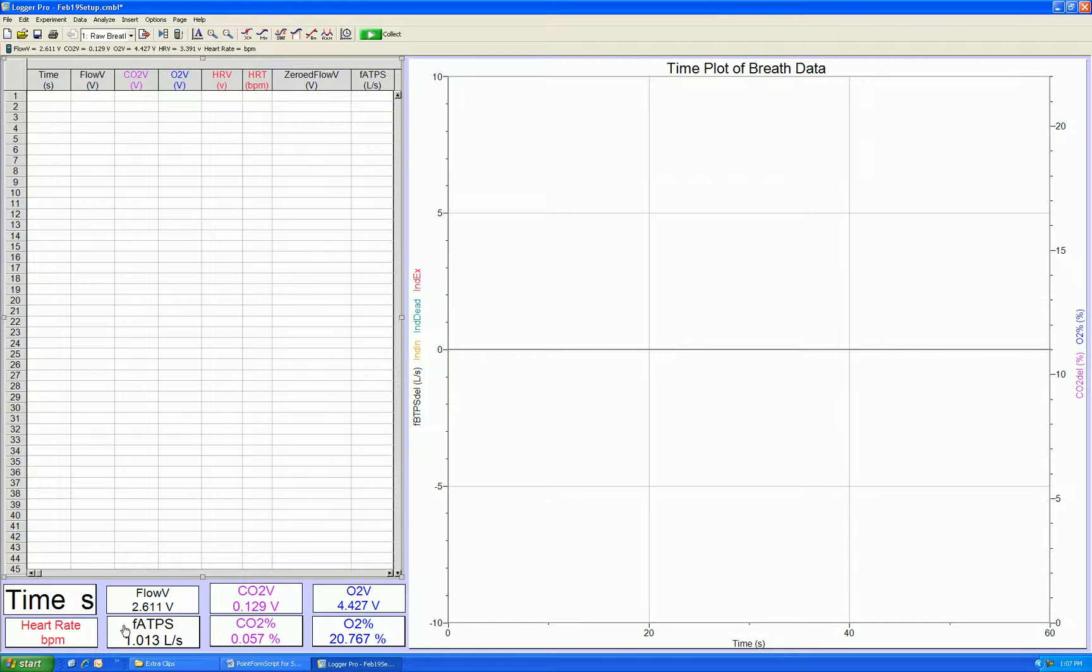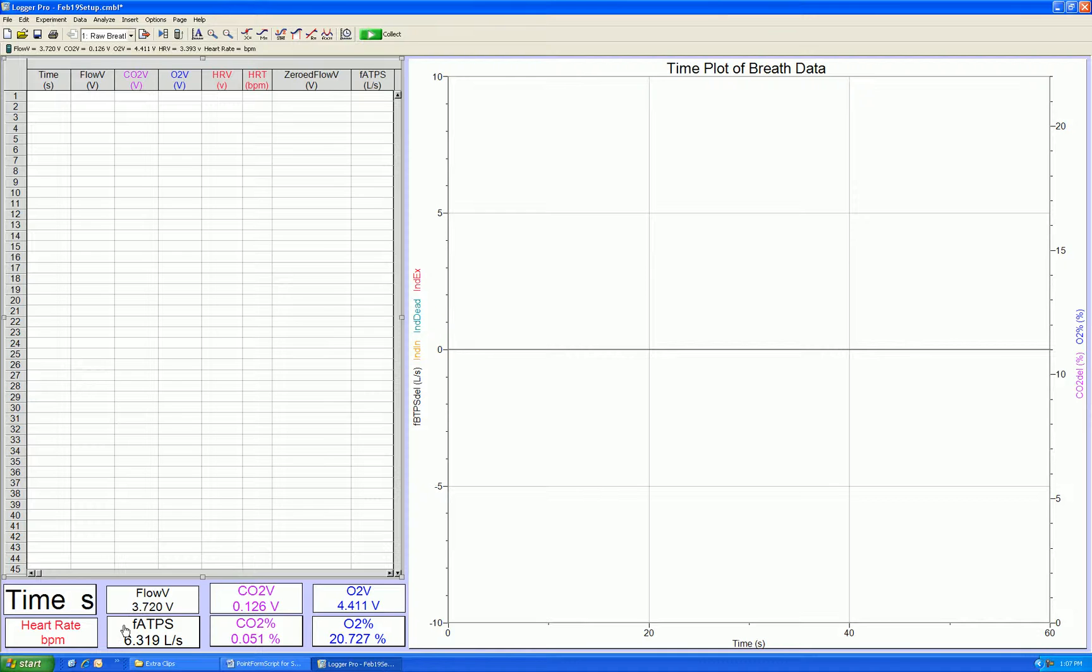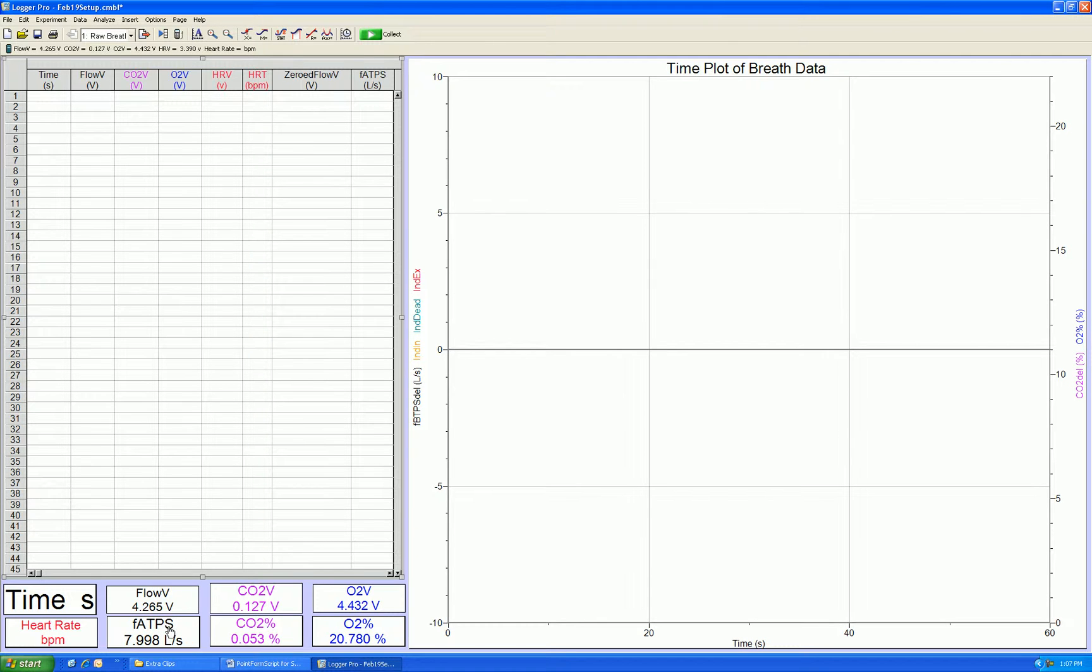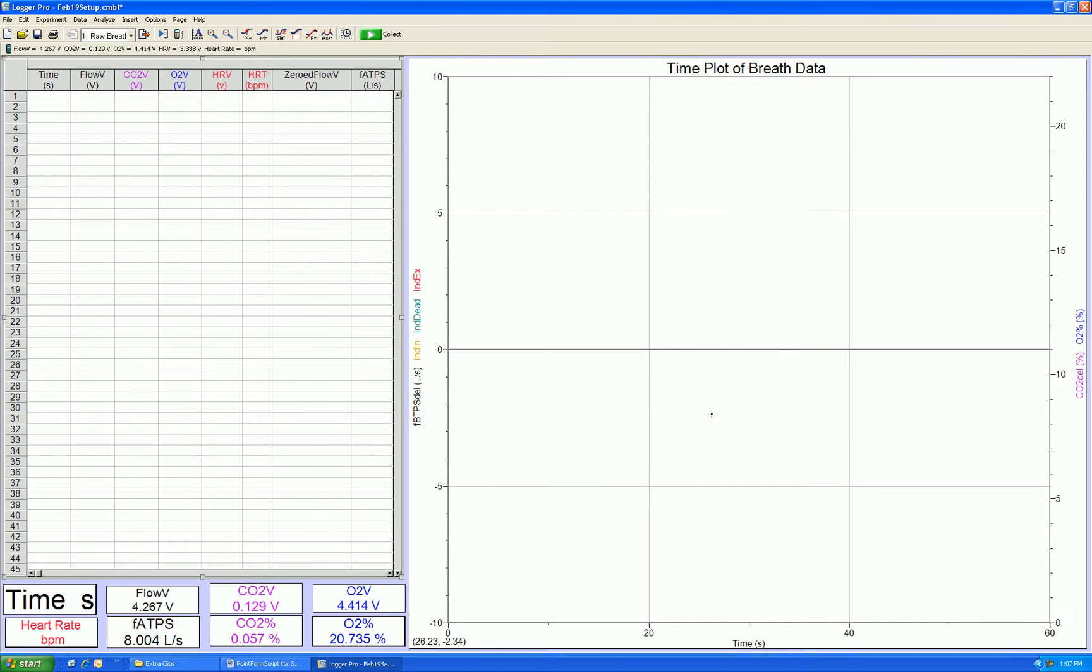If you are more interested in high flows, use the small bore tubing, and you see the flow is read at about 8 liters per second. Again, if this is not the case, adjust the PTAC span to obtain 8 liters per second. So now we have calibrated the flow meter.